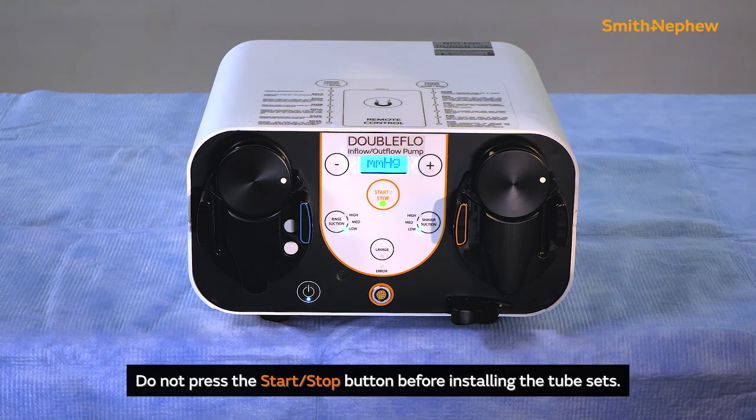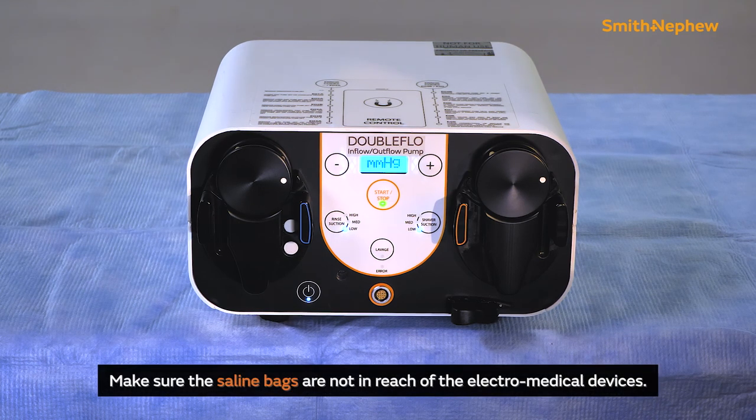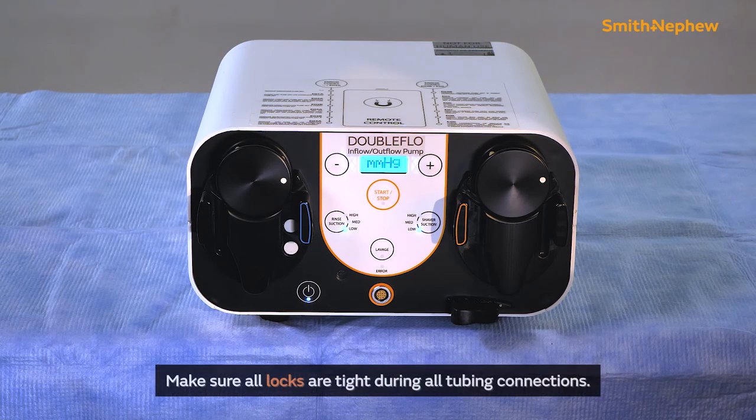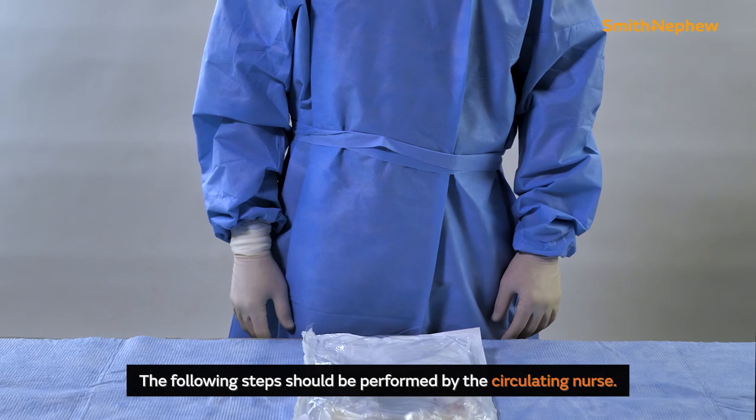Do not press the start-stop button before installing the tube sets. Make sure that the saline solution bags are not within reach of electro-medical devices before installing the tubing. Replace empty saline bags before setting up tubing. Make sure all locks are tight during all tubing connections.